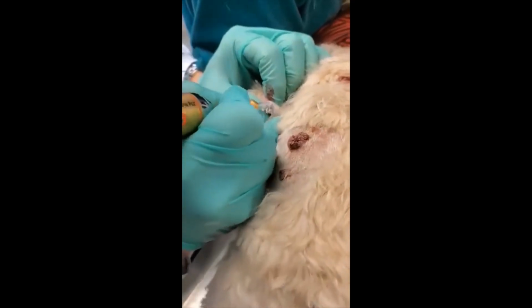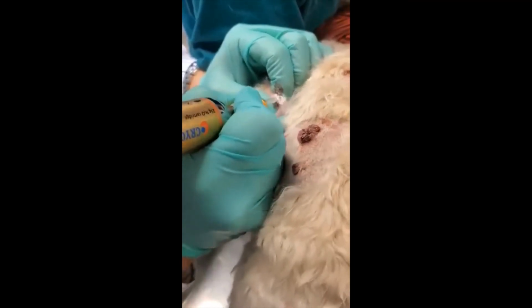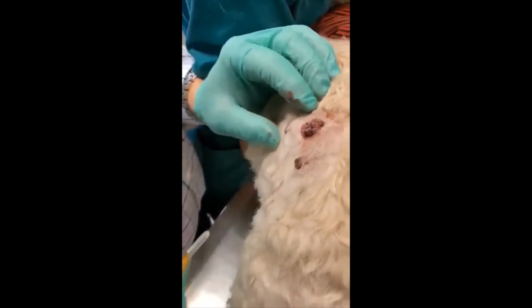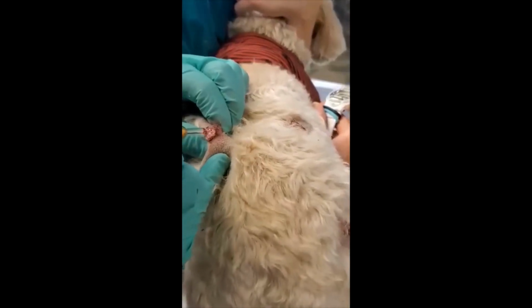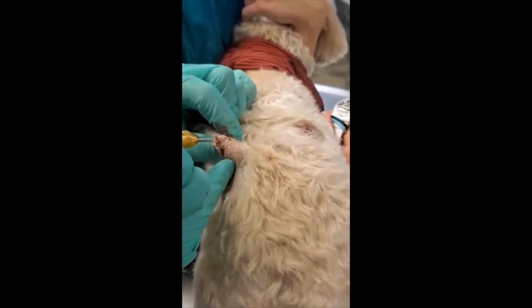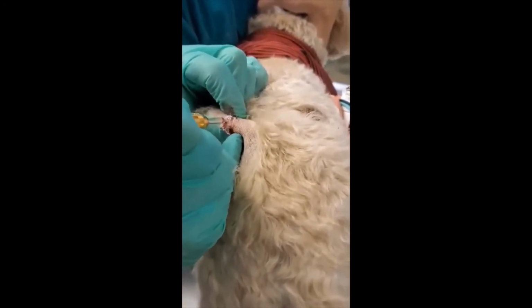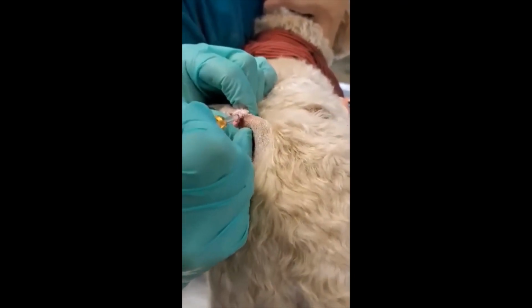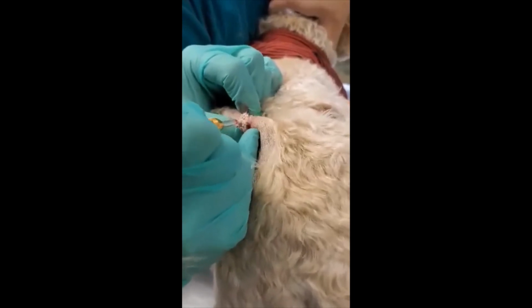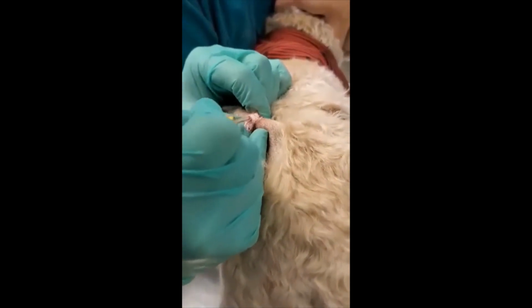There is minimal to no post-cryo complications. Occasionally, these dogs will lick at the lesions, and so we'll use a body stocking or an Elizabethan collar to prevent self-trauma during the necrosis and healing phase. Again, client satisfaction is very good, patient acceptance is excellent, and post-cryo scarring is minimal at best. Done.